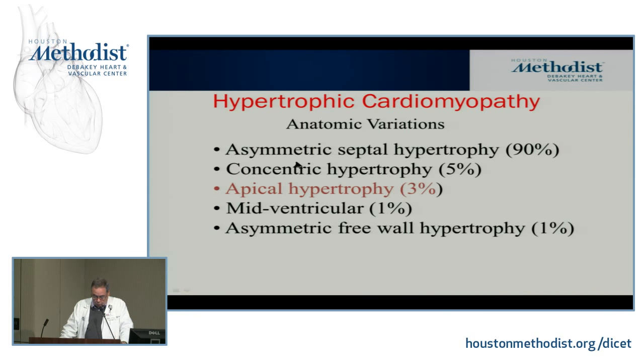You should also know that although asymmetric septal hypertrophy is 90% of these patients, about 5% come in with concentric LVH, with or without SAM. One question is whether this concentric LVH is just a phenotypic expression of the genetic mutation they have, or whether they have so much LVOT obstruction that they also get secondary posterior wall hypertrophy. Interesting discussion, because quite often you can see some of this concentric LVH with a lot of SAM and obstruction too.